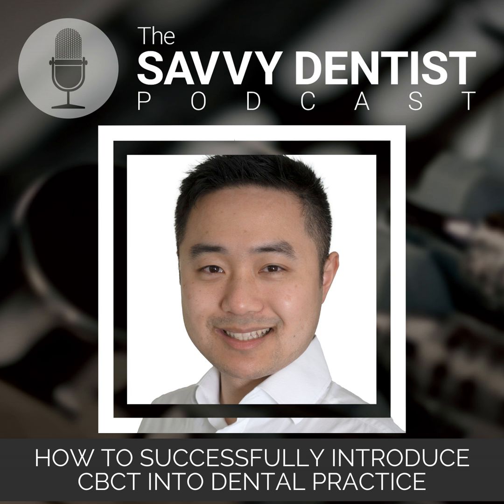Now if you think about dental CBCT, which is 100 times less than that, then we're talking about 9 additional cancers in 1 million, or in 10 million people every year, and over a period of 10 years, that's still very, very small numbers. So once you truly understand that, I don't think you need to be frightened of radiation. It's simply knowing that yes, it does cause some harm, but if you truly believe that sending your patient for a CBCT will offer better diagnostic information and a better patient outcome, then that shouldn't stop you.